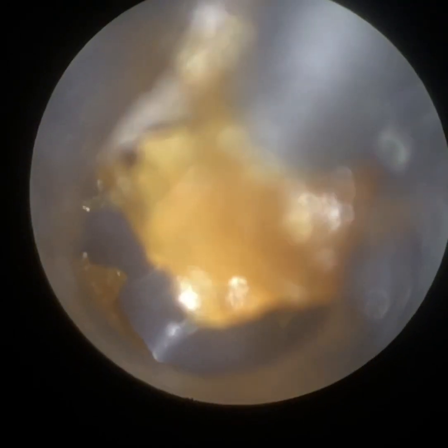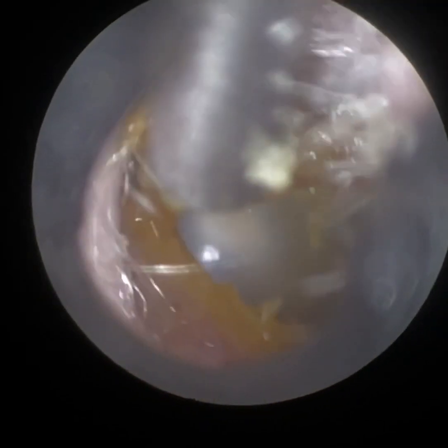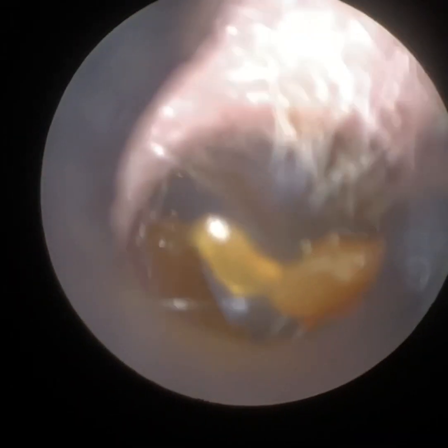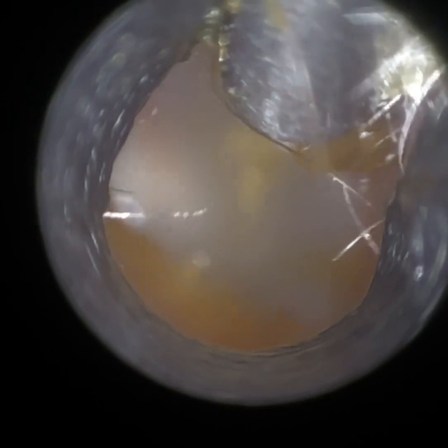If you continue to watch, you will see some still images of the Waxscope to give you an idea of its design and how it's held and operated. Before that, though, we're just going to remove this wax that detached itself from the main plug of wax that I just removed.